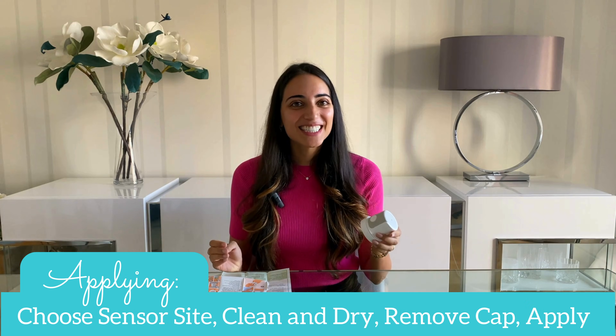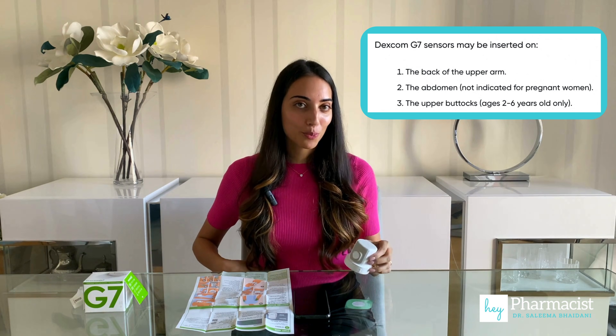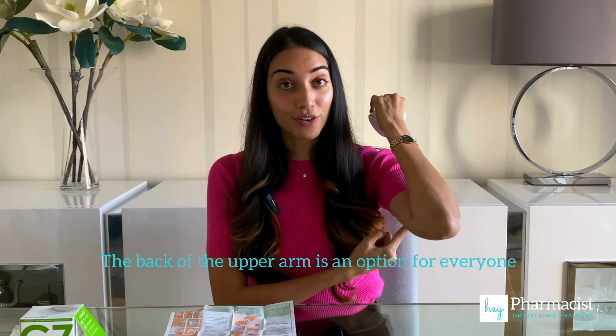The first thing to decide is where the sensor is going to be placed. Patients have the option of the upper arm for anyone. There's also the option to put the sensor on the abdomen, except for pregnant women. Children between the ages of two and six also have the option to place the sensor on the upper buttocks. But just to reiterate, the back of the upper arm is an option for everyone.